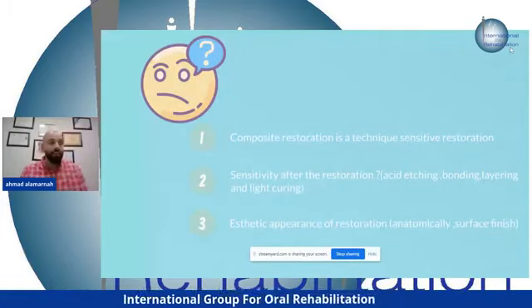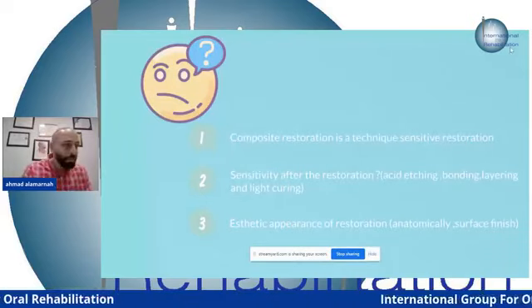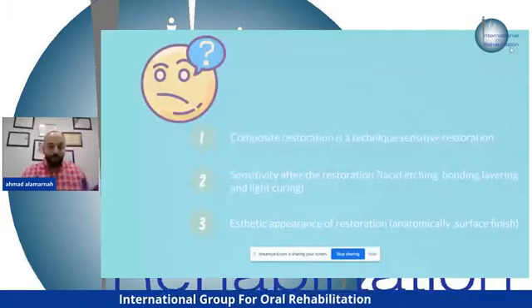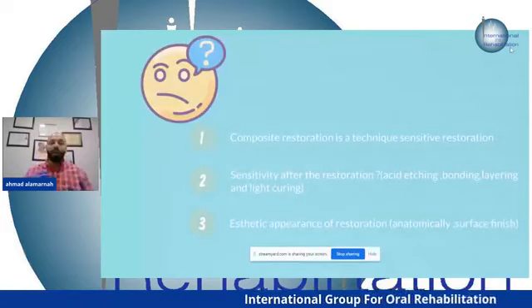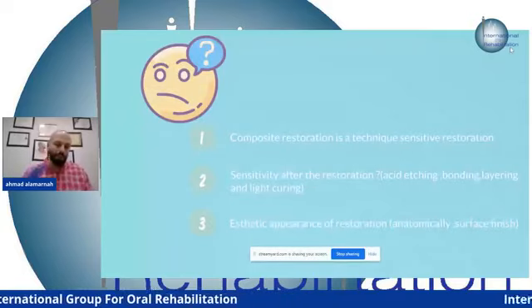It's technique sensitive. It can be affected by moisture, even from the breath of the mouth. So when the patient is breathing, the water vapor in the air from the patient's mouth can affect my restoration. So there will be an obstacle.